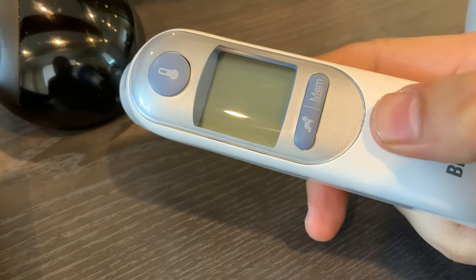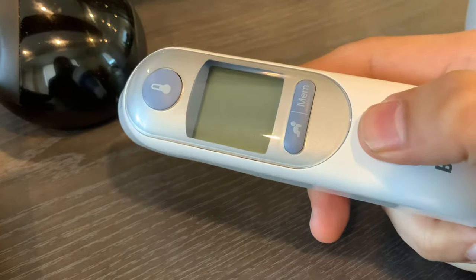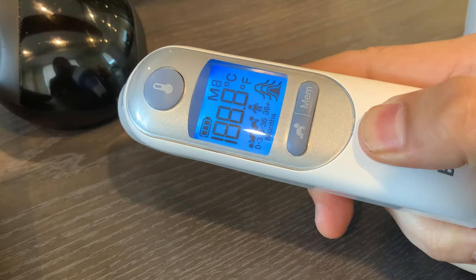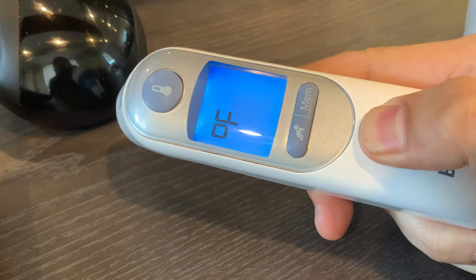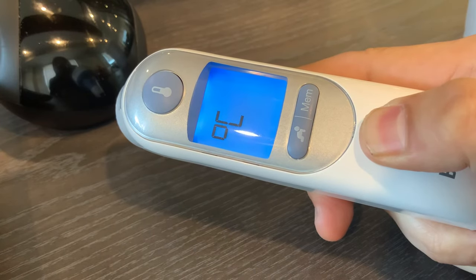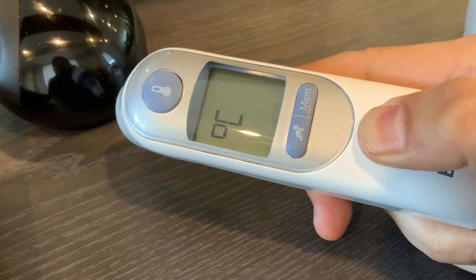So to change it, you pretty much have to hold this power button when it's off. I'm gonna hold this power button and it's going to show C and F — it's gonna go through a variety of settings: Fahrenheit and Celsius. So whatever you like, if you want Fahrenheit just let it go when it shows the F, or if you want Celsius just let it go when it shows the C.